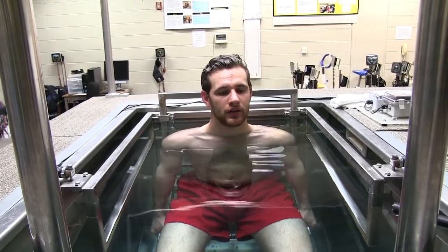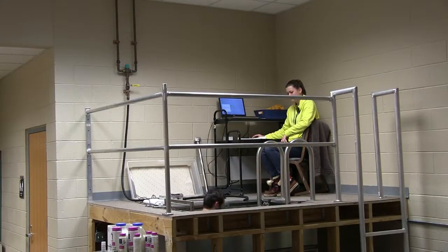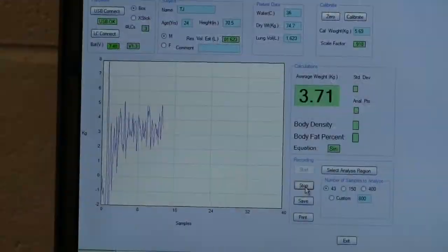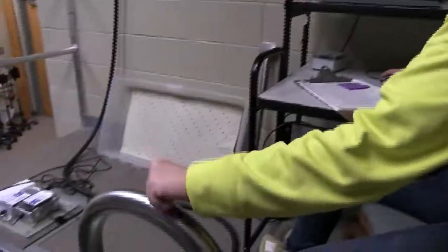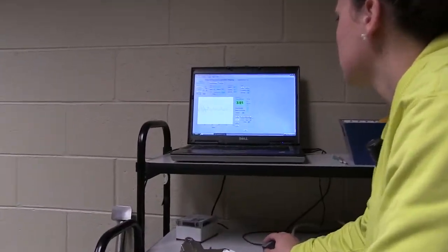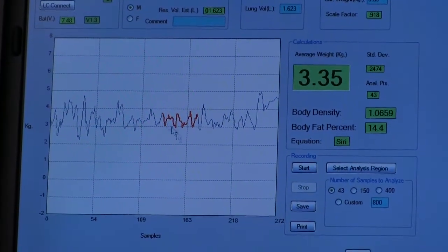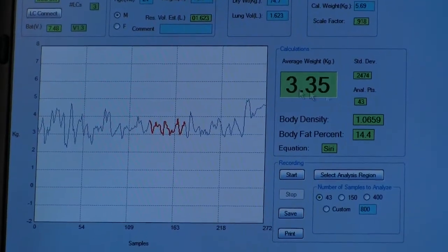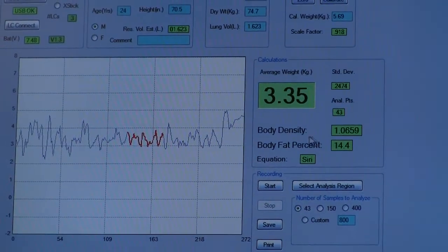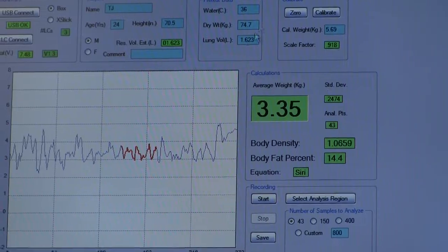Whenever you're ready, expire all your air. Now I'm going to select an analysis region — I'm looking for where the signal hits that flat point, which is usually somewhere in the middle, and you can adjust as needed. Here it tells us the average weight, which is the subject's weight in the water. From that we can calculate body density and body fat percentage based on the information we plugged in.